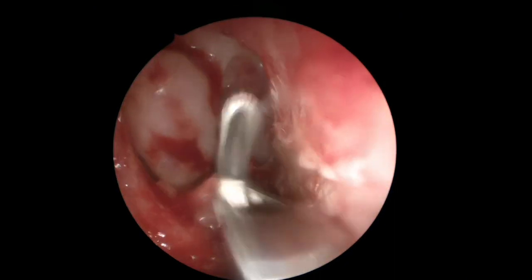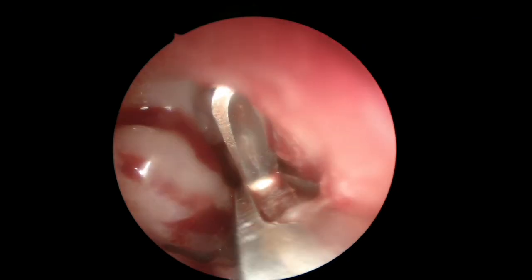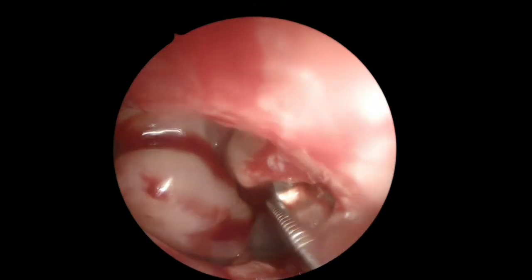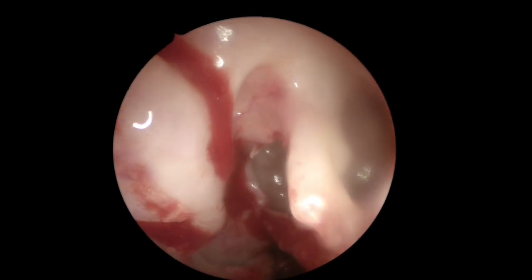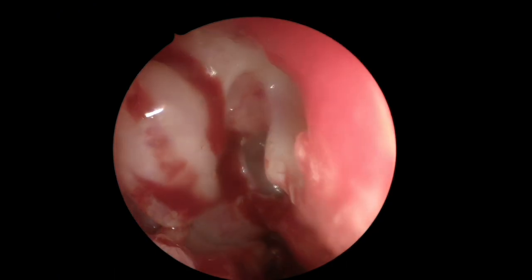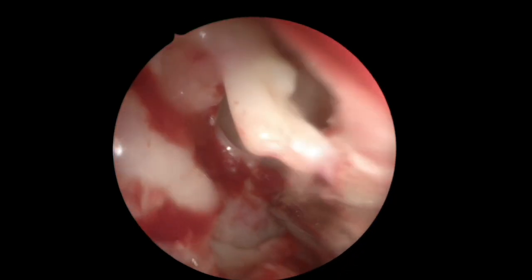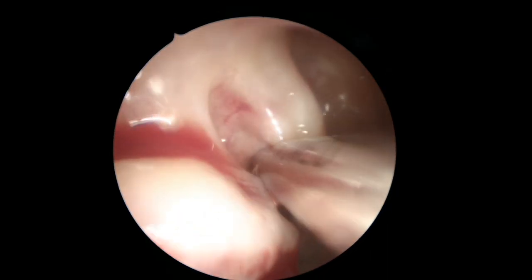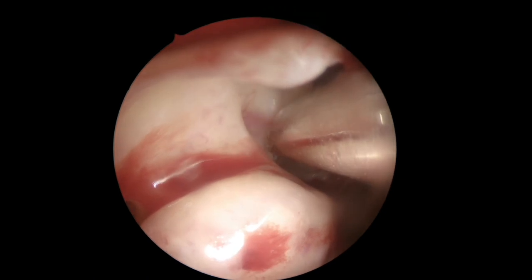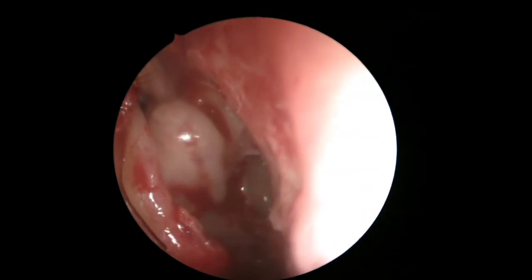Remember that the posterior wall of the maxillary sinus is a very important landmark because it's one of the landmarks that doesn't change throughout your surgery. You will use it to find many structures. Another landmark I like to expose constantly is the posterior table of the frontal sinus. If you take all the fronto-ethmoidal cells and expose the lamina papyracea and open a Draf 2A to the frontal sinus, you will see the posterior table of the frontal sinus all the time.